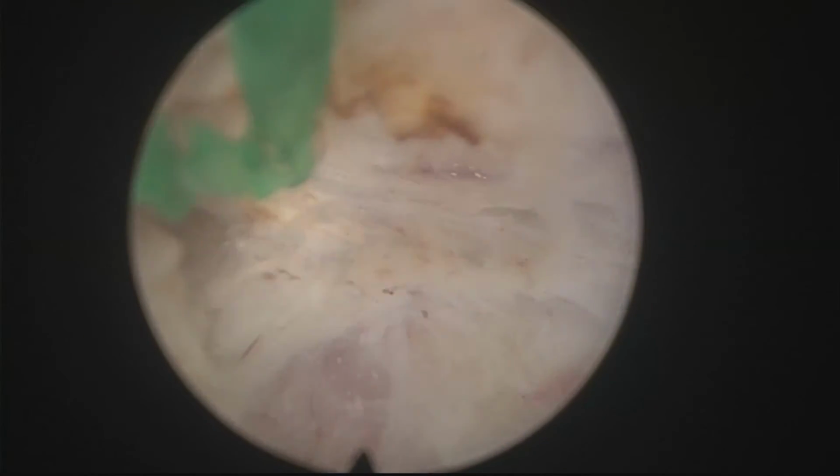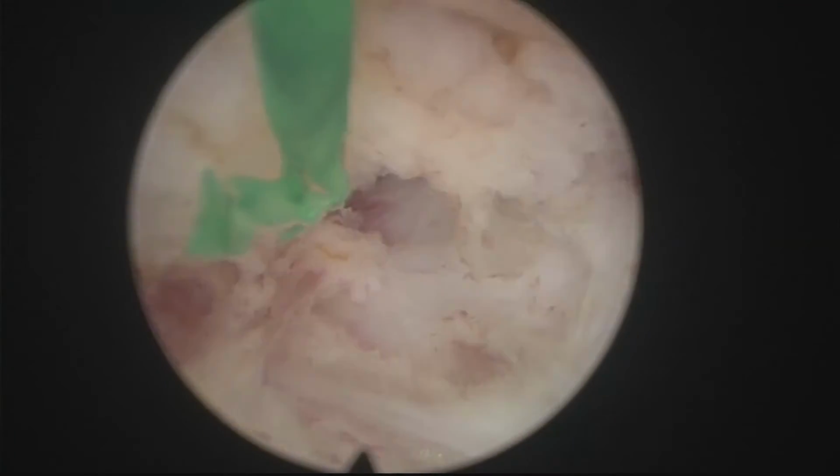You shouldn't hurry, just take it easy, progress slowly, and this will take you to the fastest possible result, I think, if you are careful and you progress without compromising the procedure and take your time to cut and to dissect carefully. Also, if you see, as we have seen, a little bit of fat in a small area, don't panic, just keep working, correct the plane.